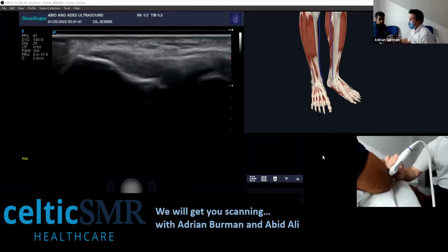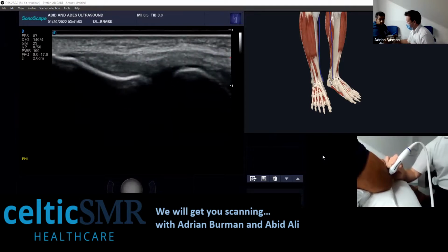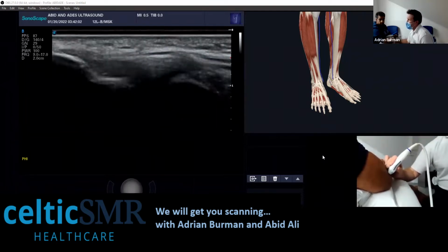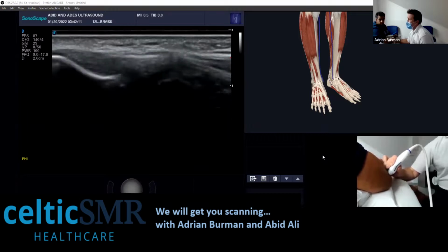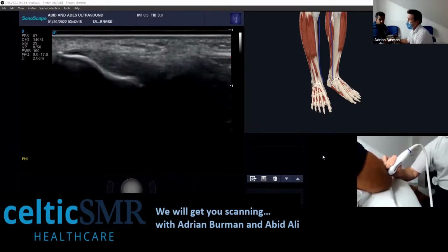Okay. And then I come and find the lateral epicondyle, and actually that's a pretty picture for your lateral epicondyle, but you really want to interrogate the ECRB, which is maybe most where it tends to happen. It just tends to move slightly upwards until you lose that bony contour there. So you just on this lateral elbow here.